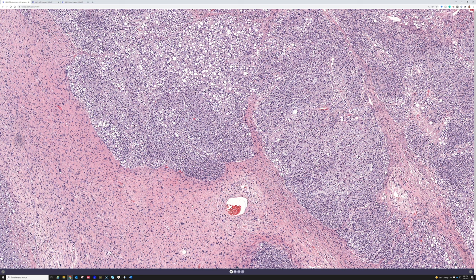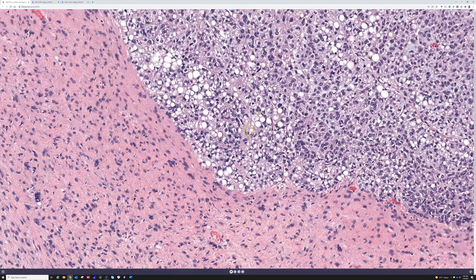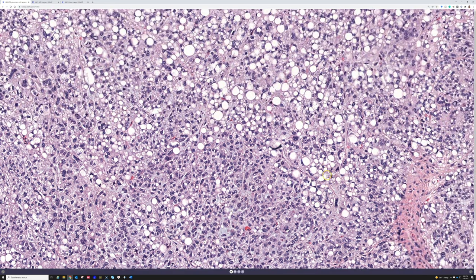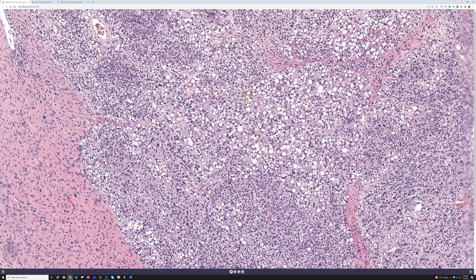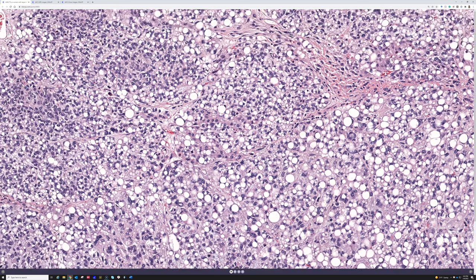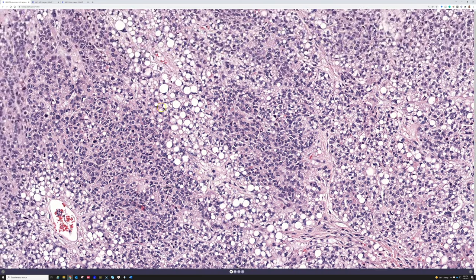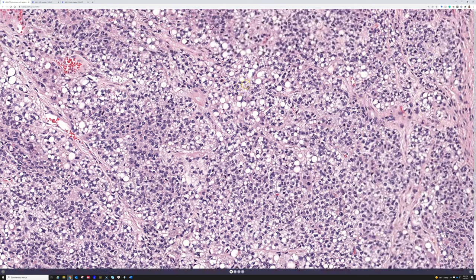They can be either pleomorphic spindle cells that resemble undifferentiated pleomorphic sarcoma, or sometimes epithelioid. This one has a little of both — pleomorphic spindle cells and areas that are epithelioid or even almost round-cell appearing. The lipoblasts are sometimes very focal, other times numerous. In this case they are numerous. Most of the time you have multiple vacuoles that indent on the nucleus, though sometimes you have to hunt around to find them.